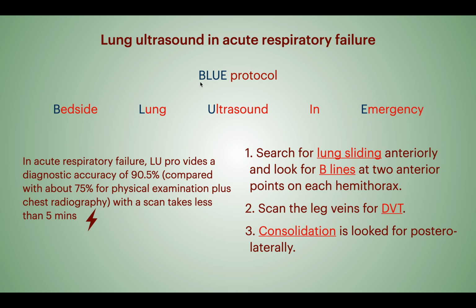I would advise, try to do that in the next 10 patients with acute respiratory problems you will see in the ICU. Try doing the blue protocol, and at the end of this presentation, I would say practice, then practice, then practice. Practice the normal lung ultrasound. Master the views, the anterior views, lateral views, posterior views of lung ultrasound. Keep practicing all the time.